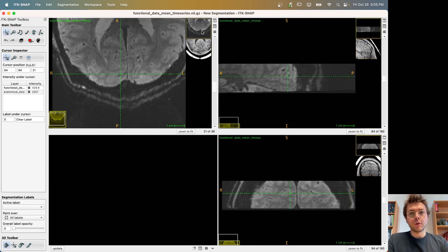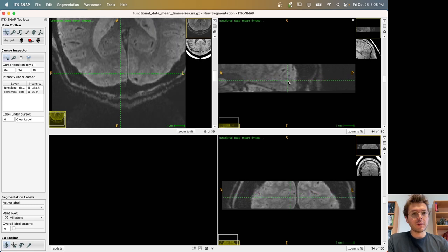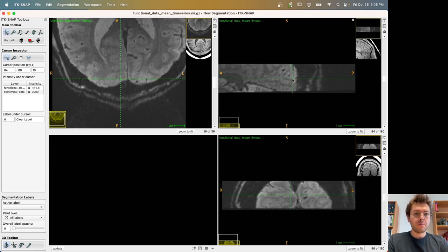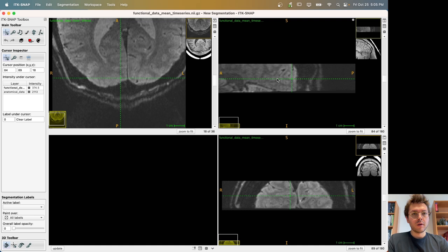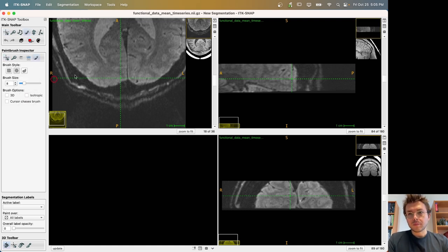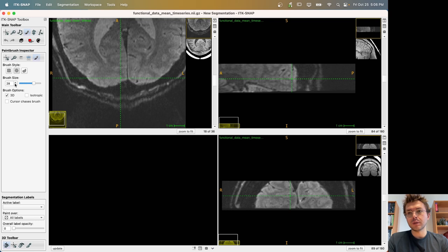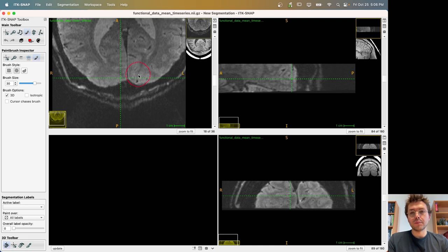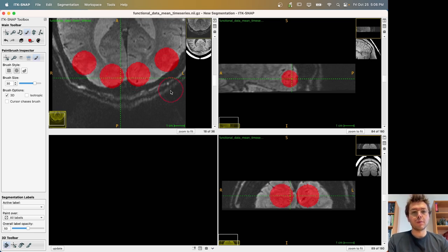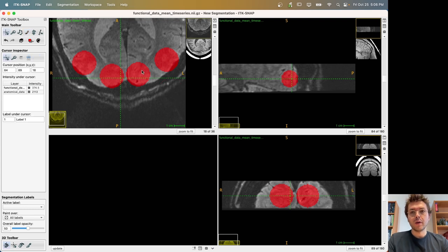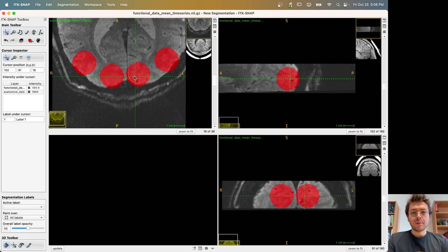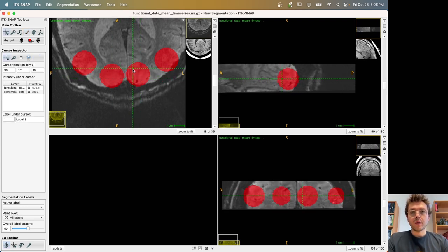First, once we are at this stage, we are going to the functional data. We kind of see one of our middle slices. And then, we start drawing a segmentation. For that, I am going to use the circular brush or spherical brush in three dimensions, and I'm going to set my brush size to 30. You can see that it is as big as this one. I'm just guessing right now, label some of the regions of interest. Let's say we want to only optimize our registration based on these four regions that we want to study further later.